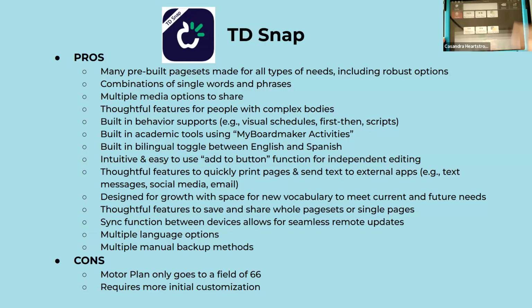This one's an example of how to wash your hands. First-then charts are in there. You can do little scripts in here, which are great. There's also a little visual timer where you can set the timer for 5 minutes, and then this little red bar will slowly turn black and then beep at the end of the time, which is great.